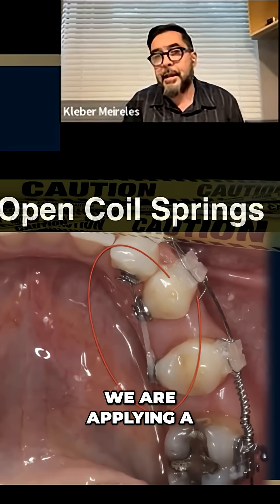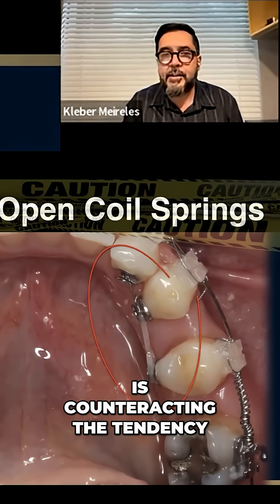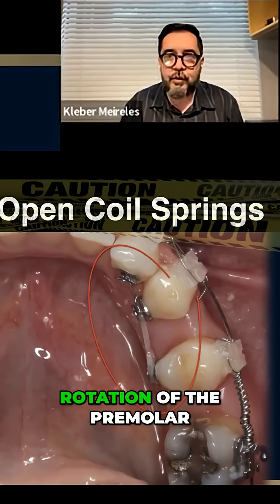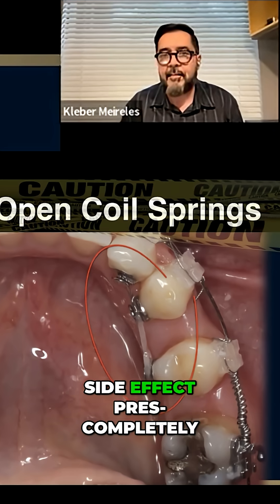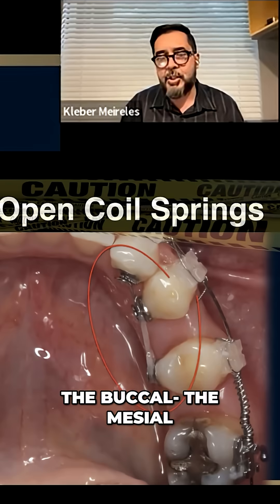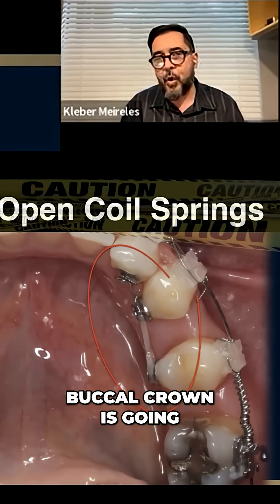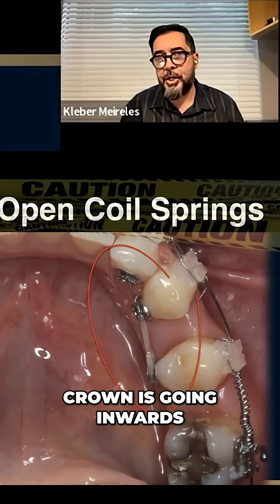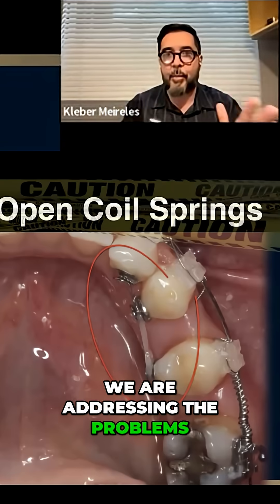You see that we are applying a force this way that is counteracting the tendency of rotation of the premolar, but we have the side effect completely present here. The molar's mesial buccal crown is going outwards and the distal buccal crown is going inwards because of the rotation. Now we are addressing these problems.